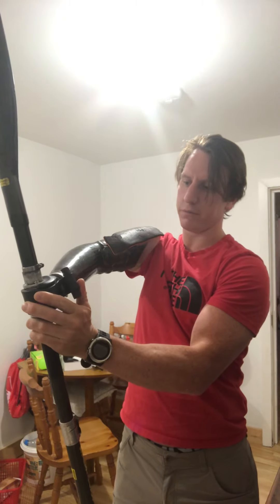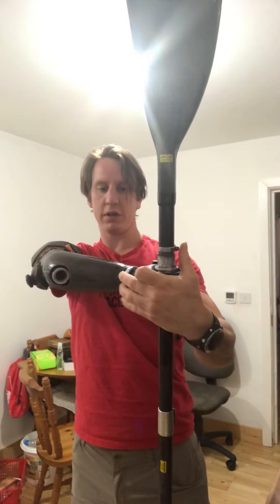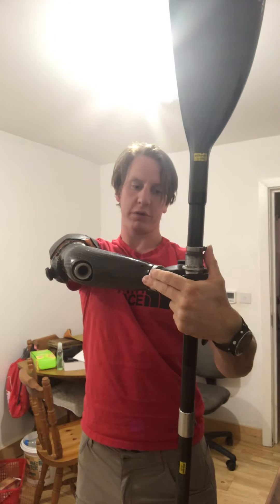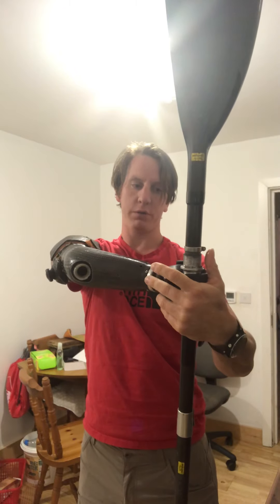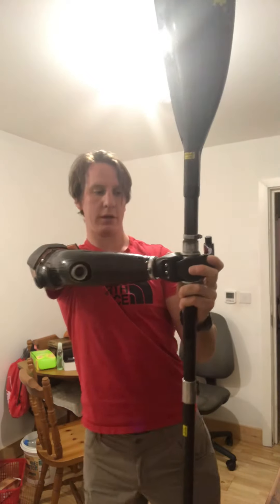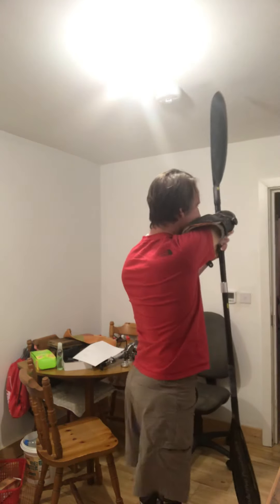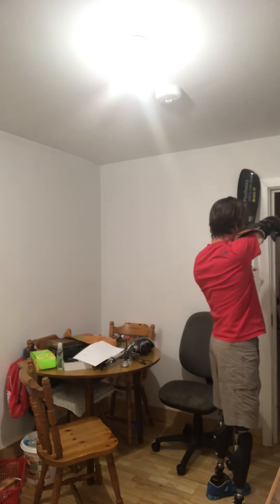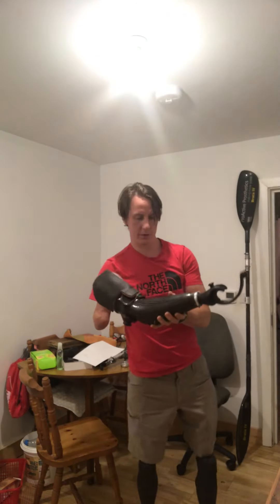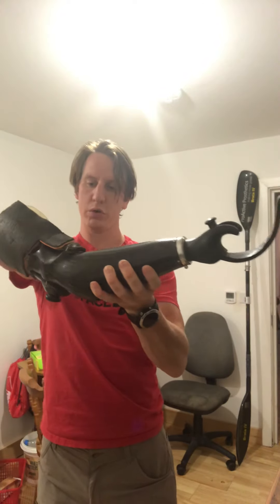In terms of how I release, I just flick it up from here, which is easy. But actually there's a second release here which can take the whole wrist and hand unit off, which will become apparent in a moment.